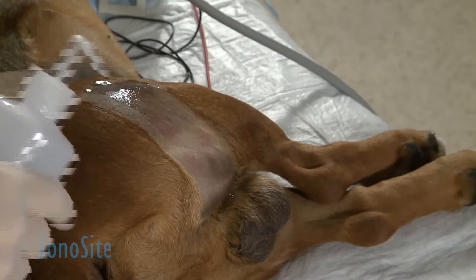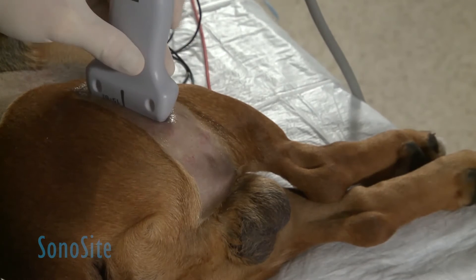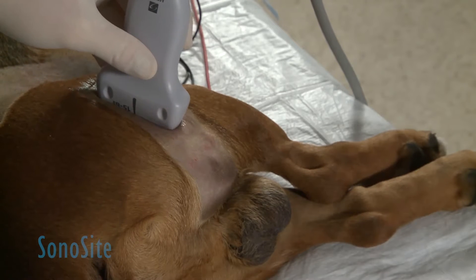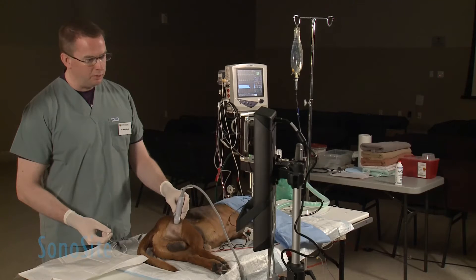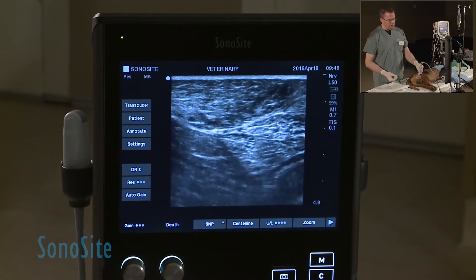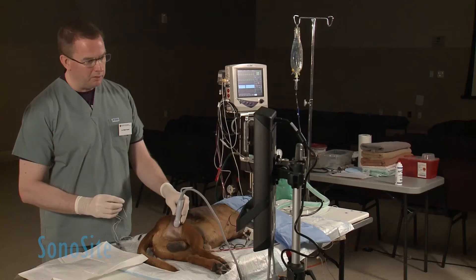We apply a little more alcohol to the skin surface to get better image quality. We place the transducer over the lateral side of the biceps femoris muscle, where we can see the shadow of the femur. We then move caudally with the transducer and try to center the sciatic nerve in the middle of our screen.